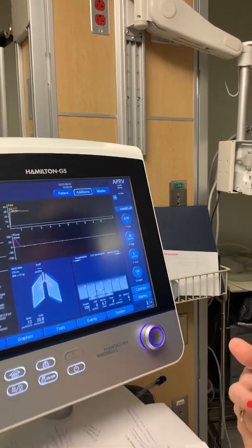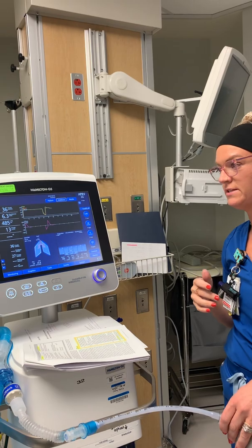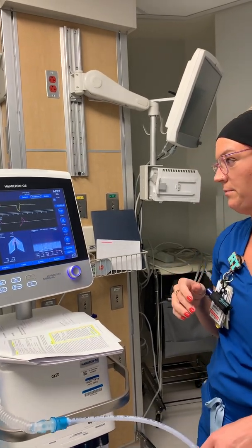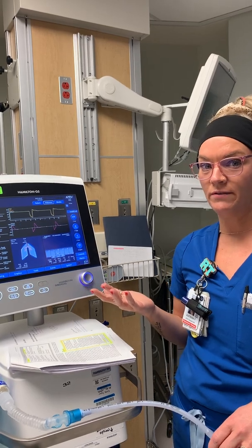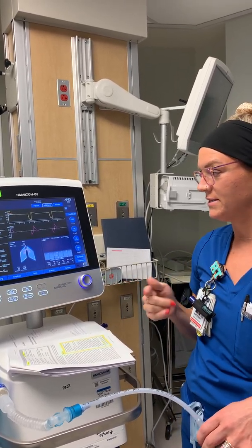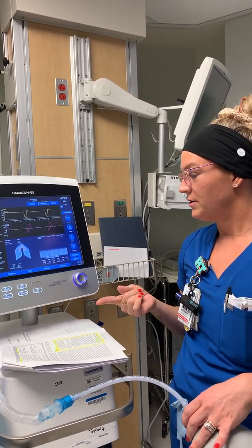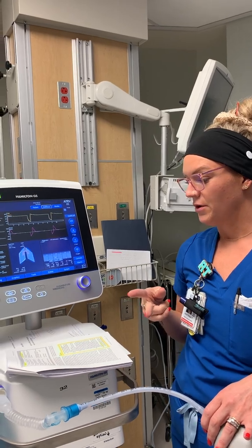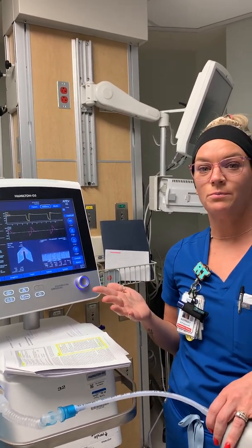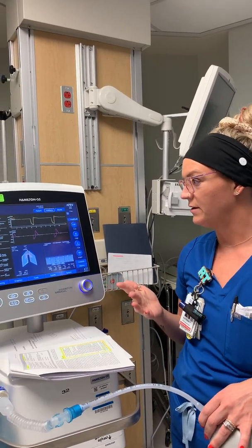Contrary to what a lot of people think, you do want your patient spontaneously breathing. We allow for permissive hypercapnia, but we want the patient to take their own breaths to help get rid of CO2, decrease intrathoracic pressure, and preserve muscle mass so there's less wasting when it comes time to wean.